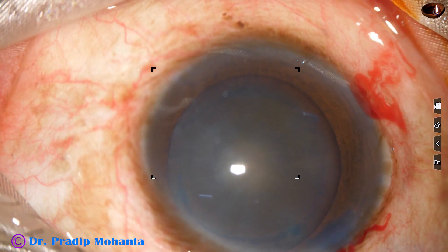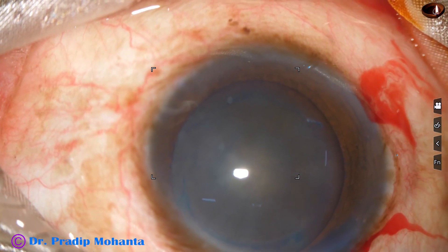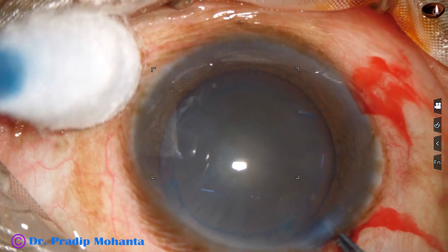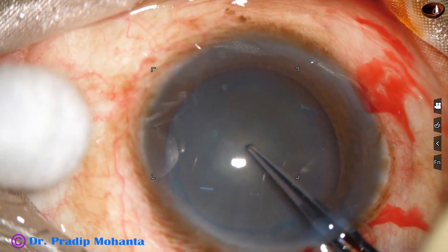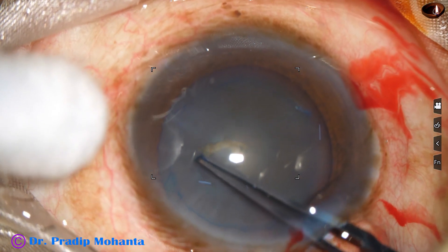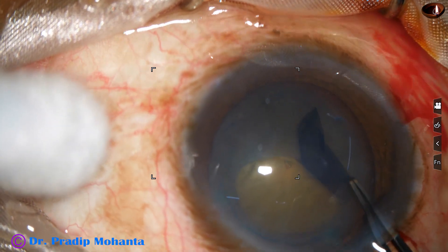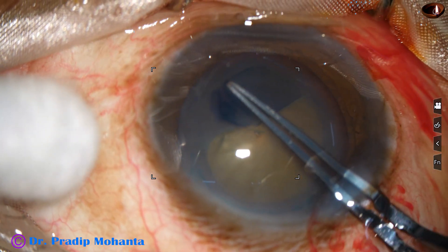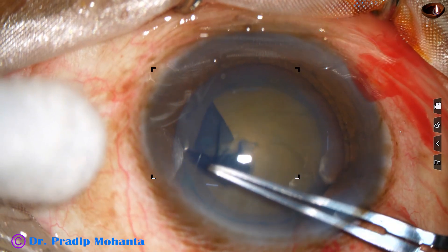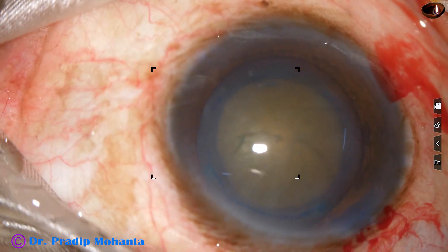And now we are going to do capsulorhexis. This cataract is quite hard — nuclear sclerosis is about grade 4 — so we need to do a large rhexis. With the utrata forceps, we scratch onto the anterior capsule to raise a capsular tag. This capsular tag is guided anti-clockwise all around to get an adequate sized rhexis of about 5.5 to 6 millimeters.